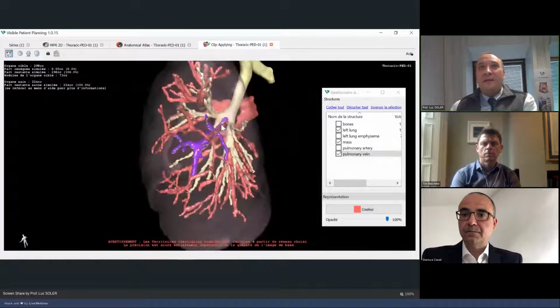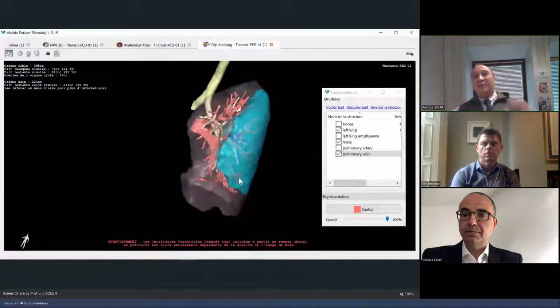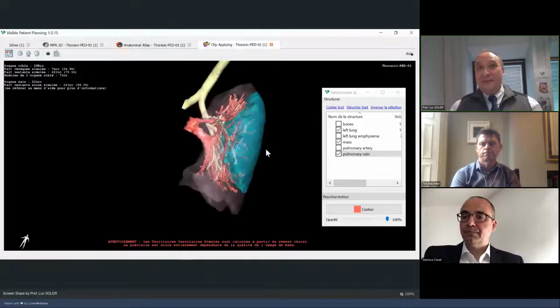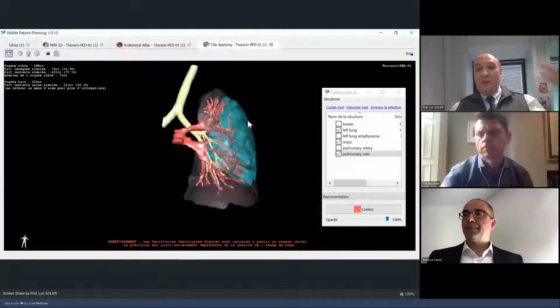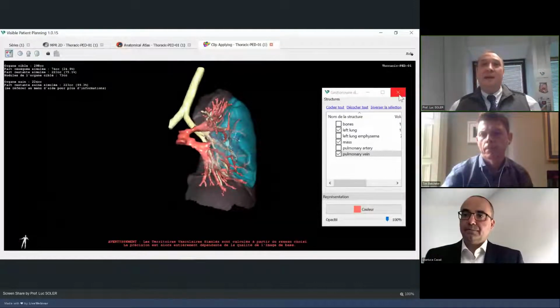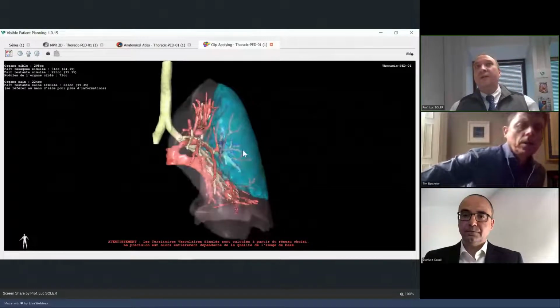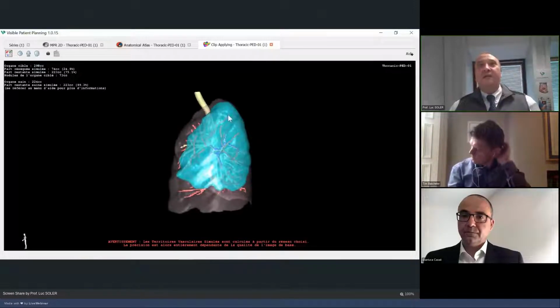And by resecting this tree, he has performed a kind of lobectomy, but you understand it's an additional lobe that does not exist in a classical anatomy. But essentially, the patient, after the surgery, had his full lung with the upper lobe and the lower lobe, as if he had no problem finally. During the surgery, the child was 6 months old. Now he is 2 years old. I can tell you that he is perfectly safe. It's another example of the benefit of the system.